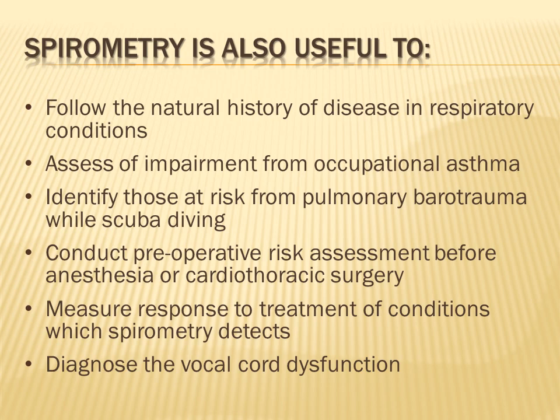You as a future doctor, you will compare the usefulness of certain medications. So if you are applying a certain medication for a patient with asthma and you would like to know if this medication is successful or not, you will send your patient to do spirometry before taking the medication and after taking the medication, and compare the result between the two states. Another value of spirometry is to diagnose vocal cord dysfunction.